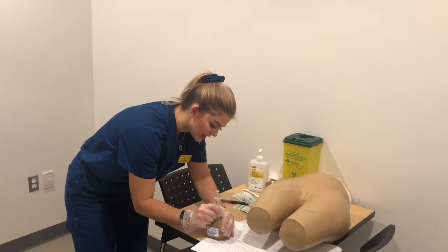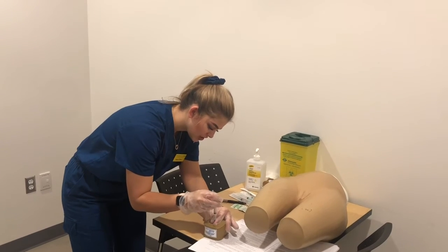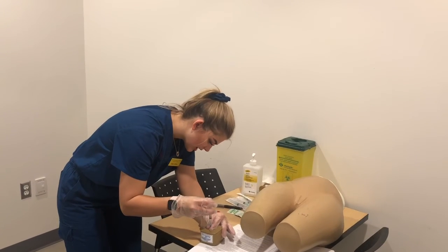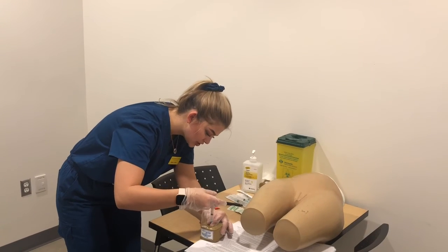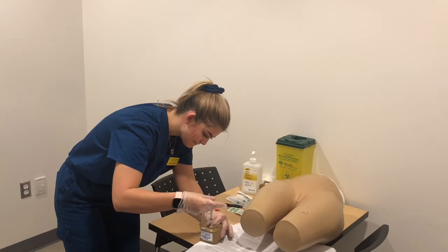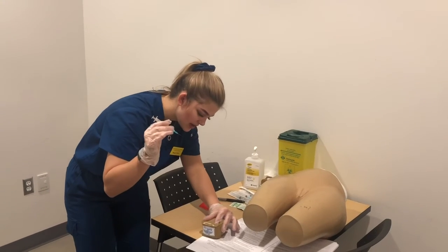Before I inject the medication, I just want to draw back on the needle to make sure I don't see any blood, to make sure I'm in the right area. I don't see any blood, so I'm going to go through and inject the medication into the patient. Going to withdraw it.